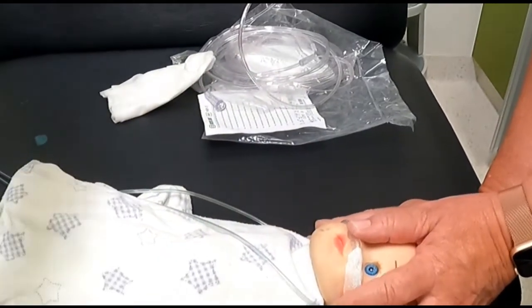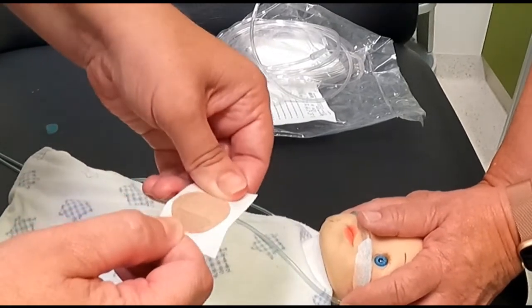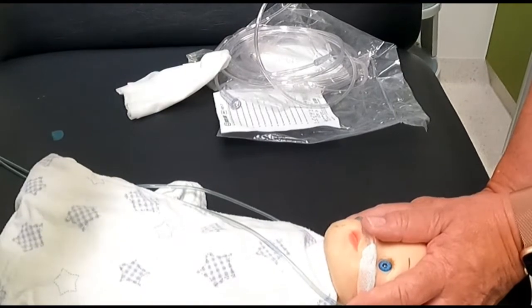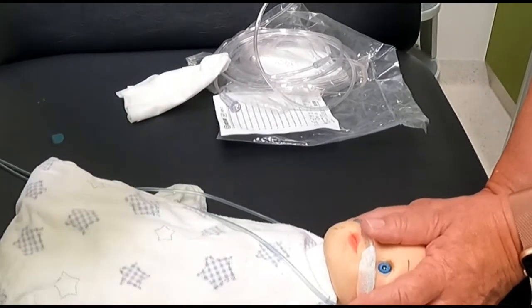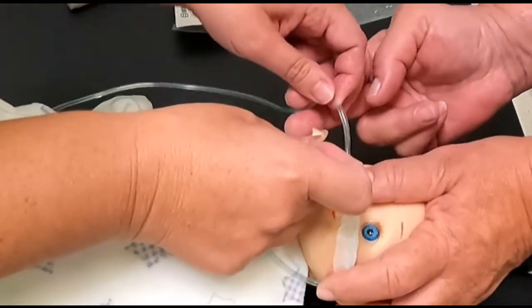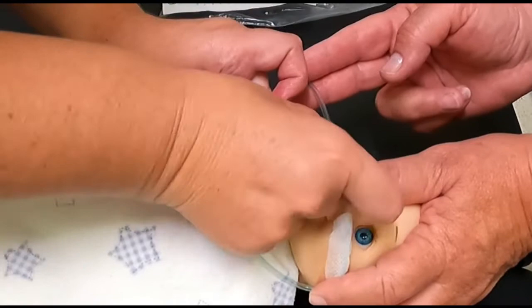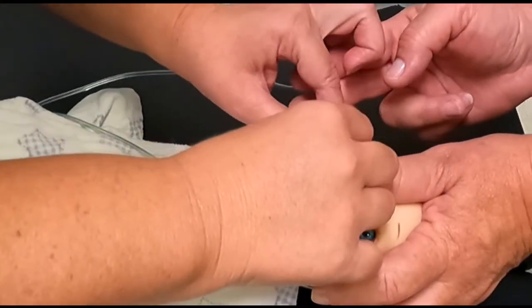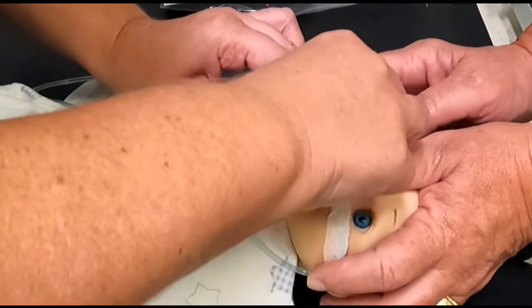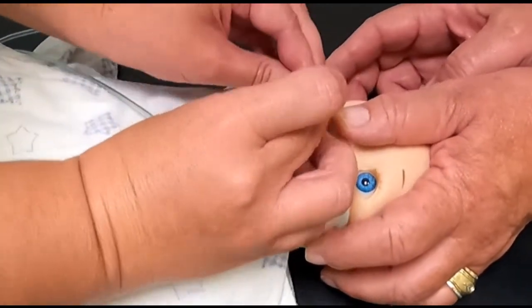The second way is to use these tender grips. These are an all-in-one system. So I just loosen up that top layer. Now, because they're a little bit bigger, I tend to put them a little bit further away. So just here, but still on your baby's cheek. And then I pull up the clear bit, pop the tubing in, and then the clear bit goes back over.